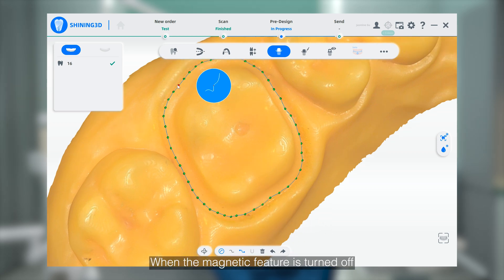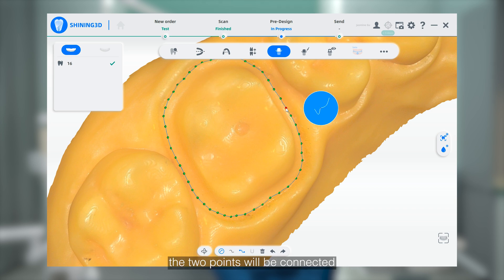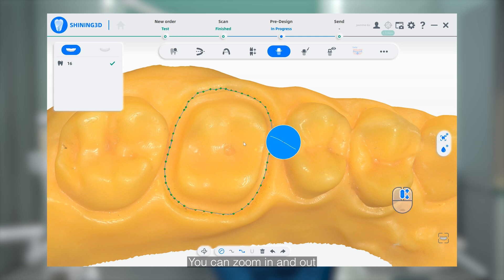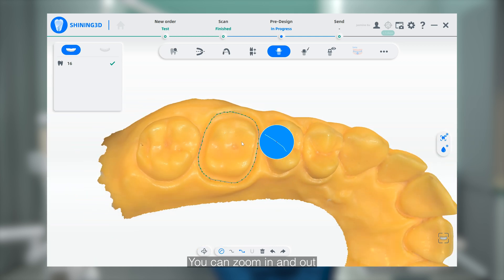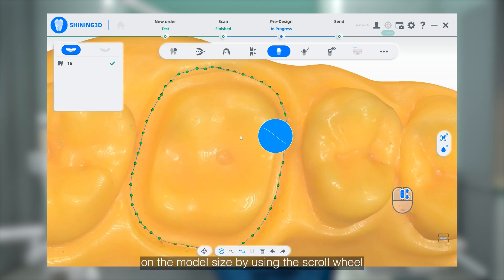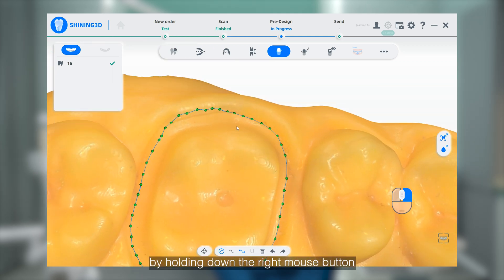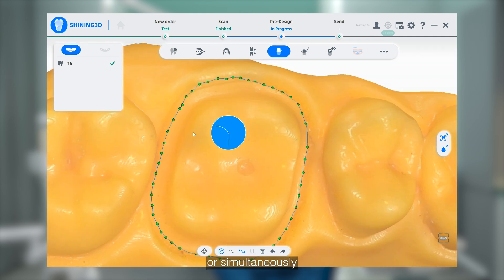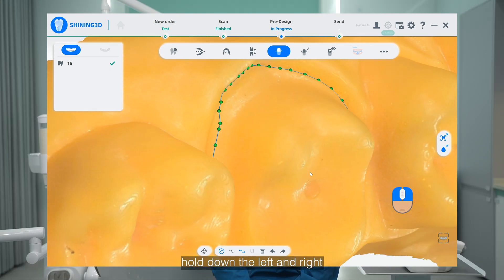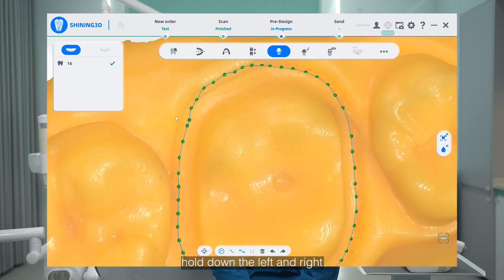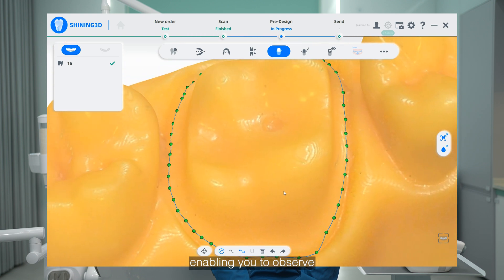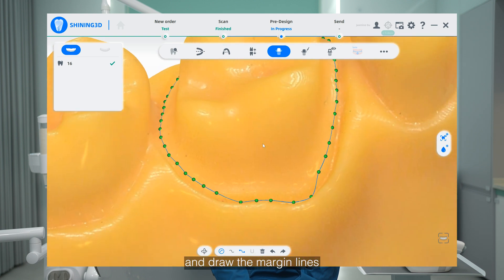When the Magnet feature is turned off, the two points will be connected by a straight line. You can zoom in and out on the model's sides by using the scroll wheel, rotate the model by holding down the right mouse button, or simultaneously hold down the left and right mouse buttons to translate the model, enabling you to view all portions and draw the Marginal lines.